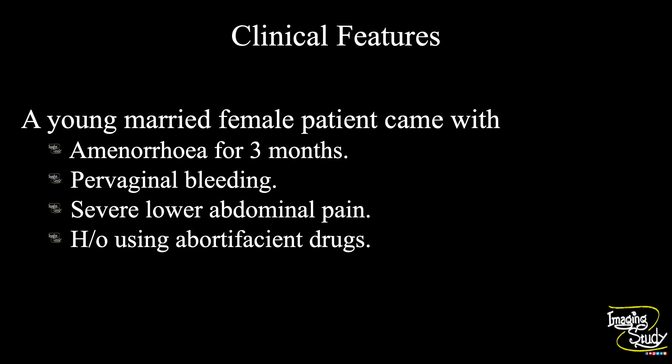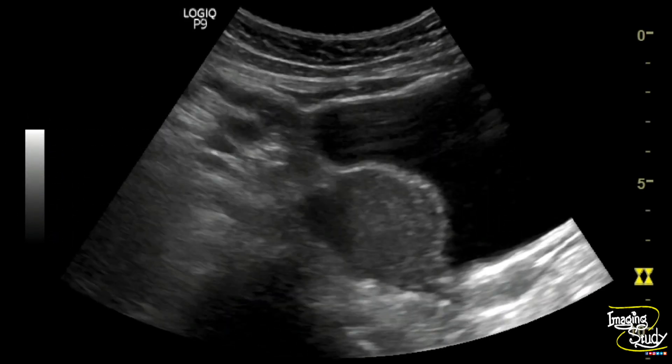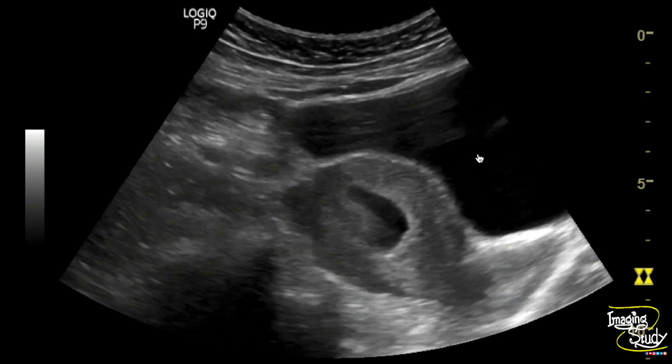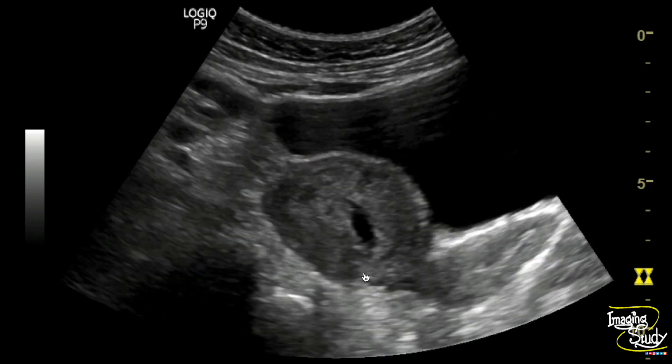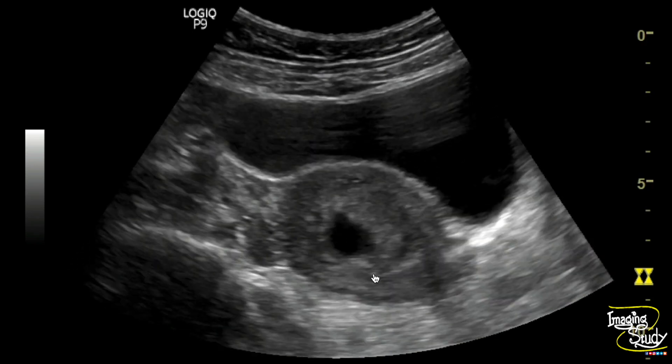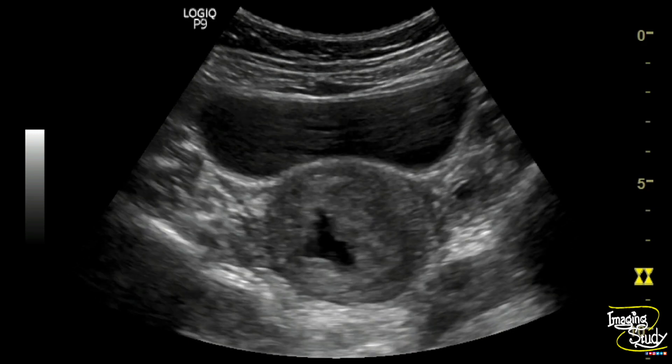Let's see what we have got on ultrasound. Here you can see the longitudinal section of the bulky uterus, and there is an irregular distorted sac noted within the uterine cavity.